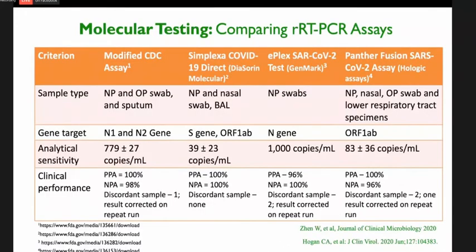There have been a few studies comparing the analytical and clinical performance of various molecular tests. This particular study evaluated the analytical and clinical performance of four major SARS-CoV-2 molecular diagnostic assays that include the modified CDC assay, the assay from Simplexa, the ePlex, and the Panther Fusion.